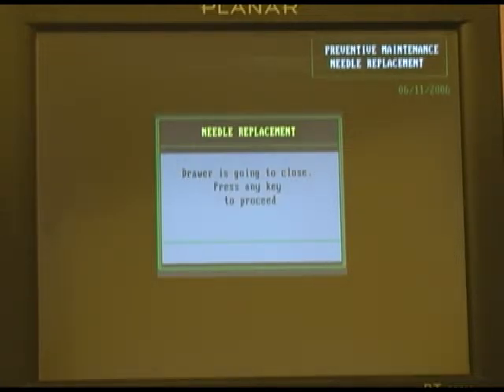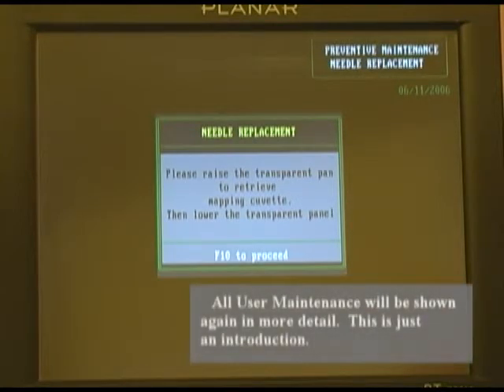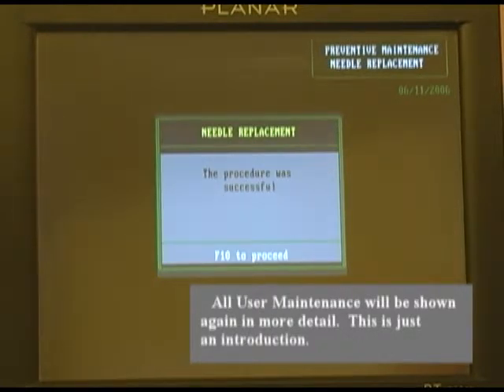Once the instrument has placed the needles back in their home position, it's going to alert you that it's going to close the drawer. It's going to then ask you to raise the transparent cover and to remove the mapping cuvette from incubation well position 16. Hit F10 to proceed.